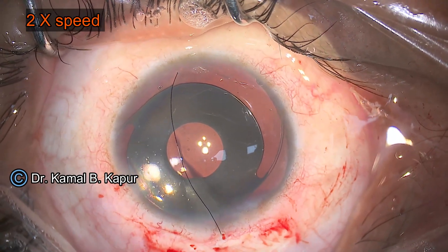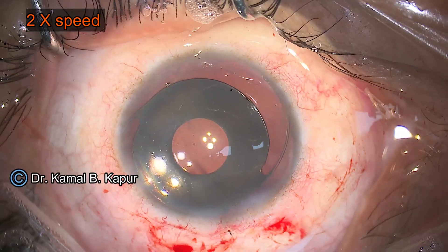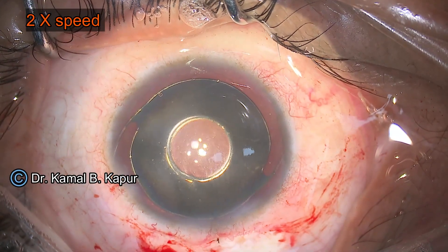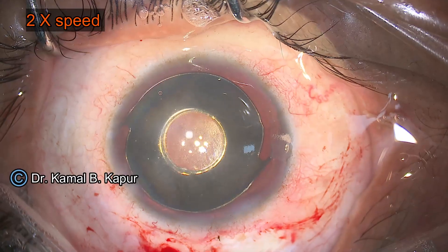Sometimes it can be very difficult to have a very large optic IOL, and once you have that kind of IOL it is very difficult to implant it within the capsular bag. So even a slight bare rim around the lens is not causing much problem to these patients.